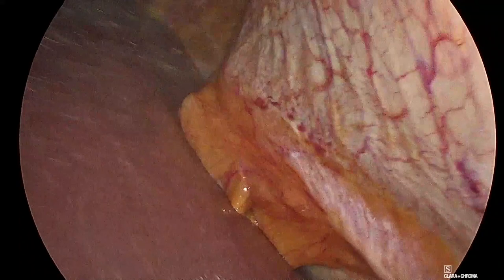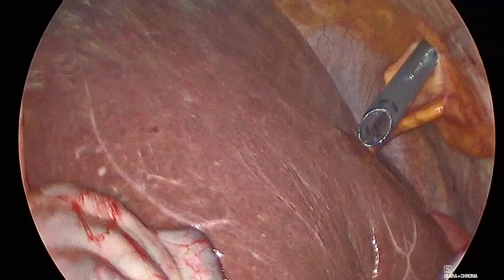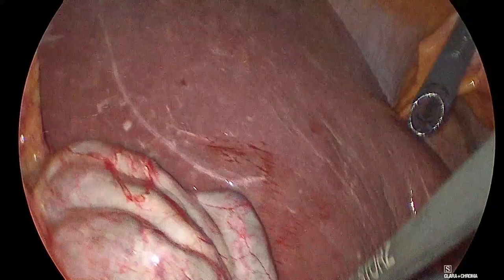Tiene una fascia esta que es durísima. Okay. Straight. Good. Perfect. So let's see if we can lift this up in a nice way.